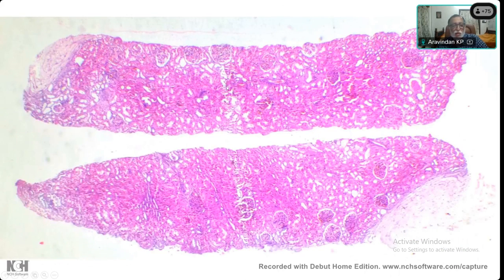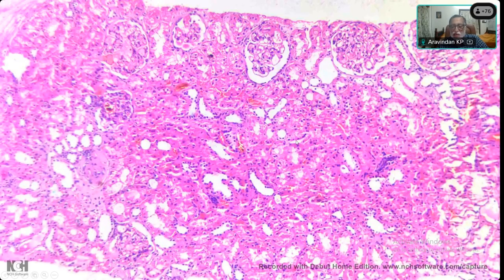So this is another picture. Again, it's confirming that all the tubules are more or less back to back. Yes, sir. Okay, when they are back to back like this, without any intervening cells, then you know that there is not much of significant fibrosis. Yes, sir. An occasional sclerosed glomerulus can be seen in older people above 50. You would expect an occasional one. That doesn't really matter all that much if you find only an occasional one. But otherwise, it looks okay.